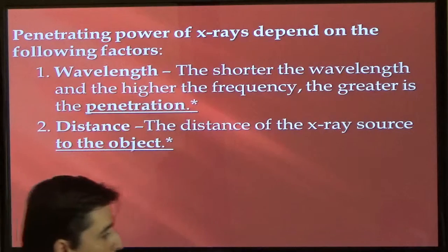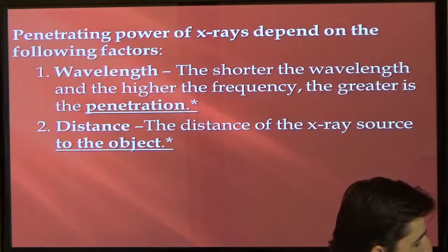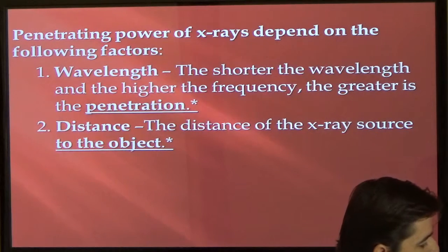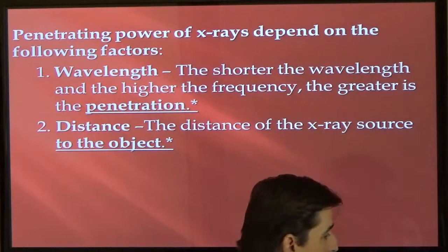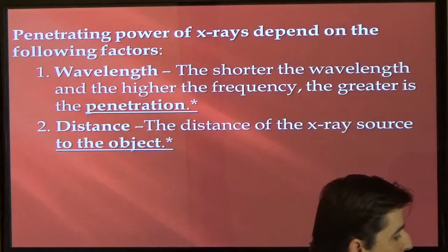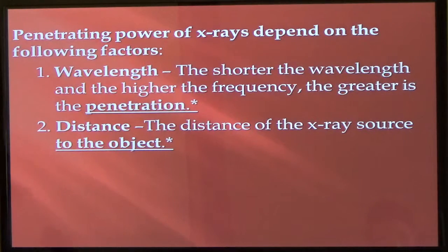So again, if we have an X-ray here, we have a tooth. If we've got a real short, a real powerful one, it's going to go through until it hits lead, okay? If you've got a long one, it may not go through. It may get to here, it won't go through. This guy's going to go through and hit the film, okay? So the wavelength does matter.